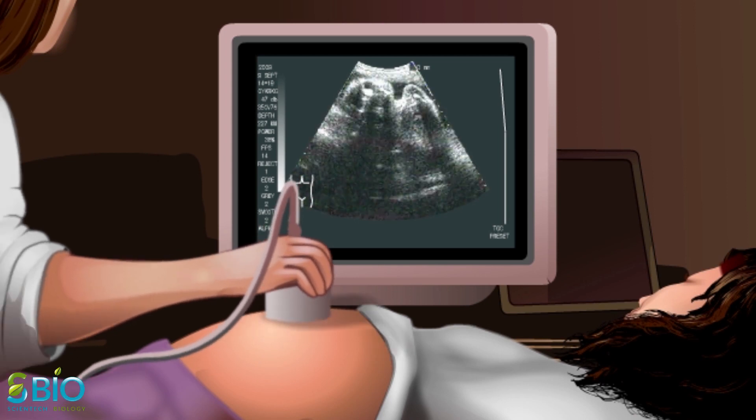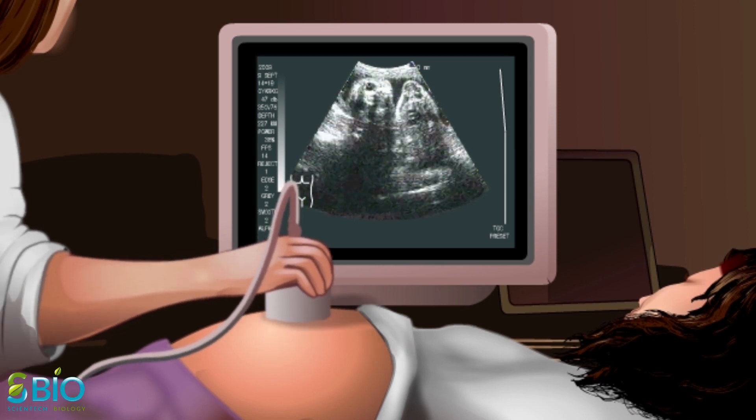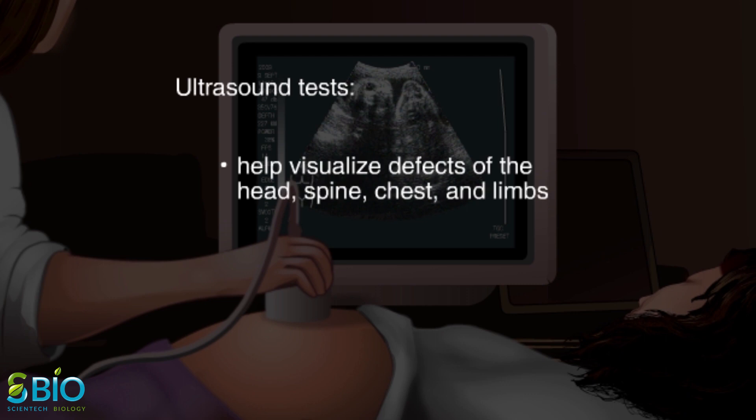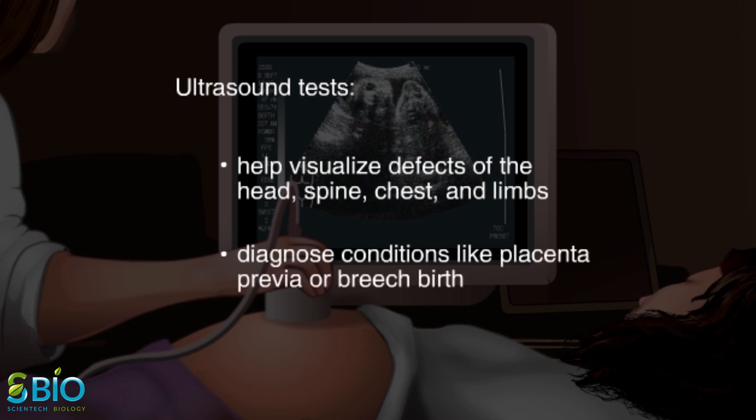Ultrasound is one of the most useful procedures for monitoring a baby's prenatal development. With ultrasound, doctors can check for defects of the head, spine, chest, and limbs, and also diagnose serious conditions like placenta previa or breech birth, and check to see whether the mother will have twins or triplets.